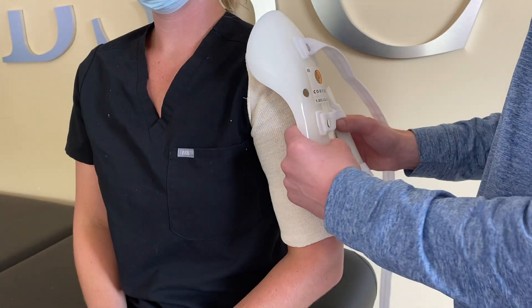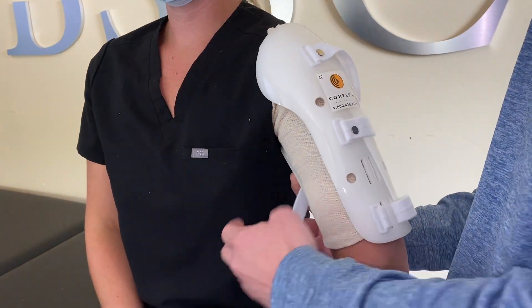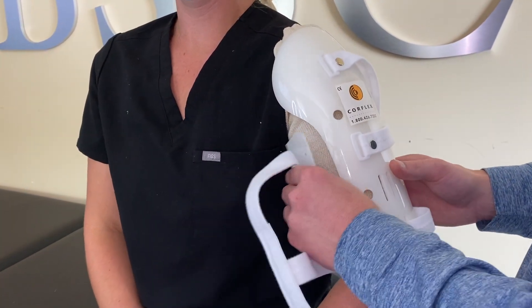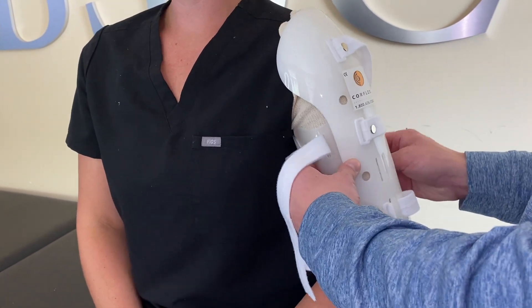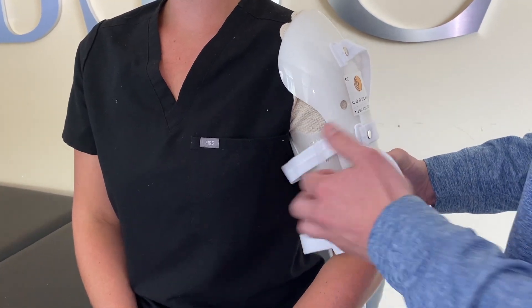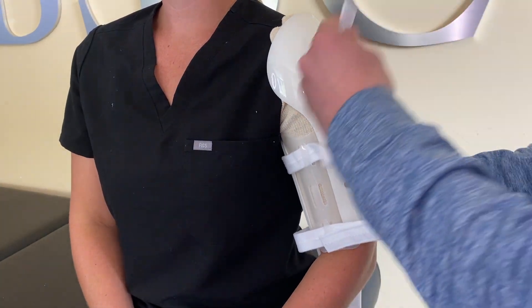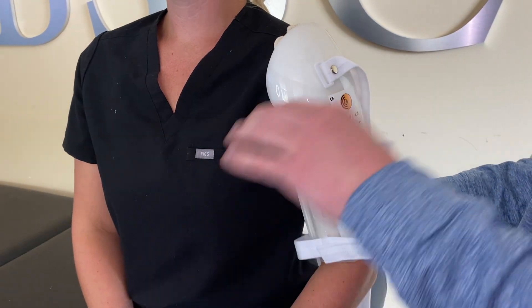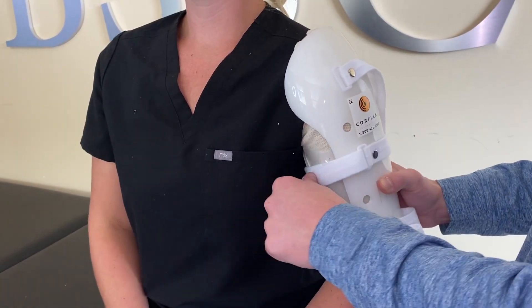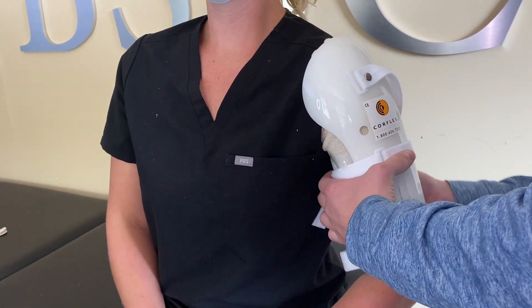Next, ensure that the buckles are facing toward the middle of your body. Loosen all the straps and remove all straps from the buckle, leaving the splint open as if it were a book. Find the round portion of the splint, called the deltoid cap, and place this comfortably on the top of your shoulder. Wrap the smaller panels around your arm through the inside, ensuring that the clear panels are tucked under the white panels.